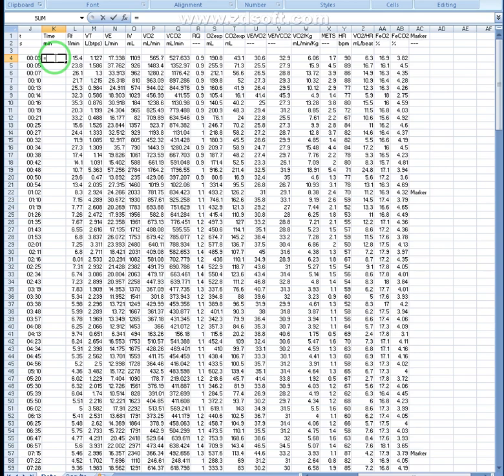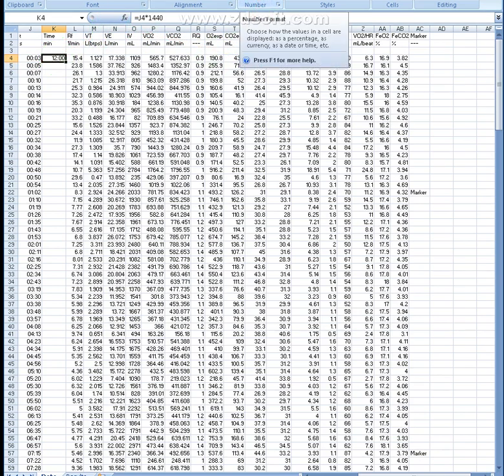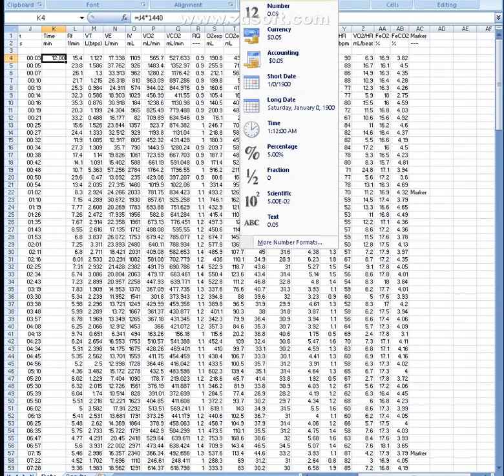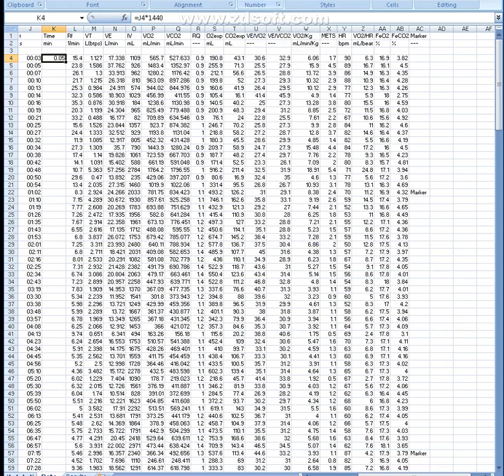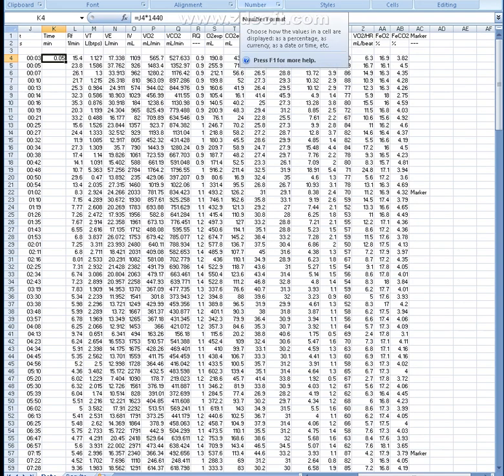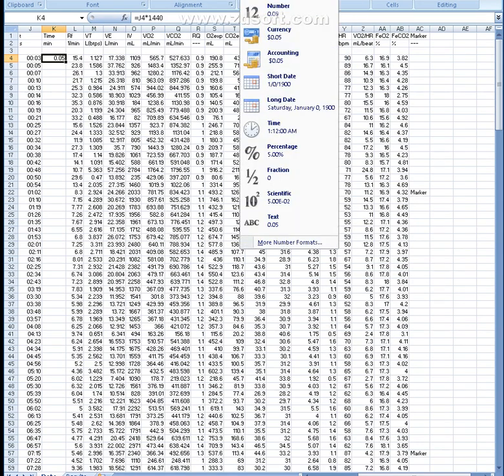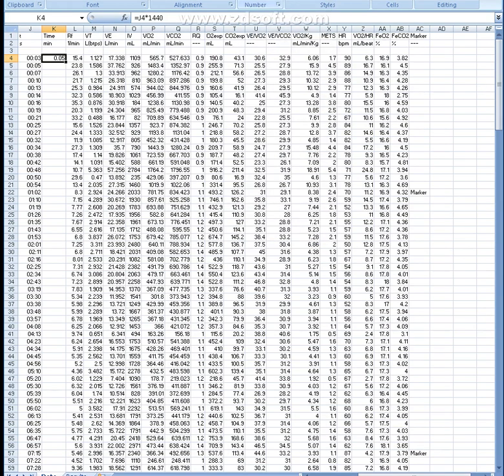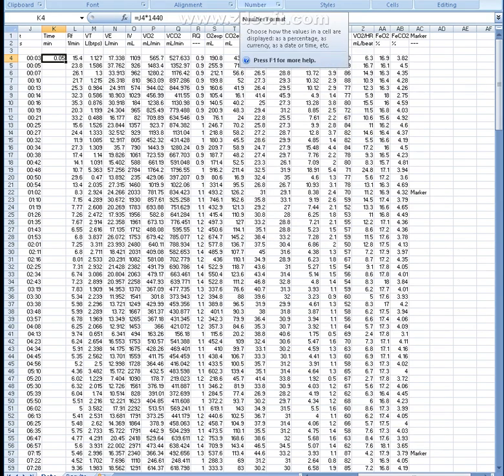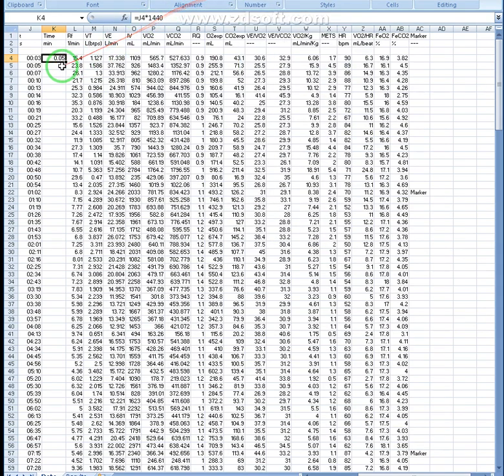We'll do equals to and then the column next to it and multiply it by 1440. You may be wondering what's that number. We got a weird custom first. So we need to change this to general. That's just under the number. You just go up and it should say custom. You want to change that to general though. This is in minutes now.